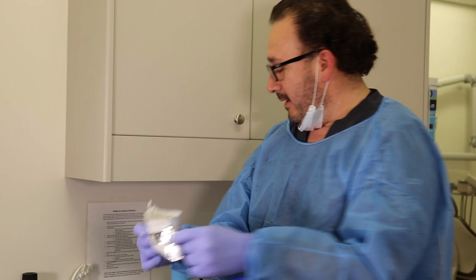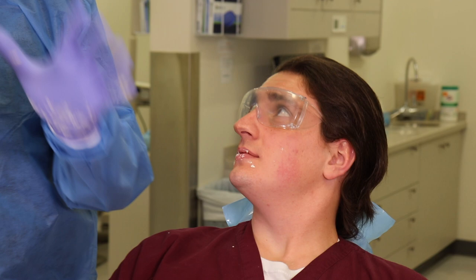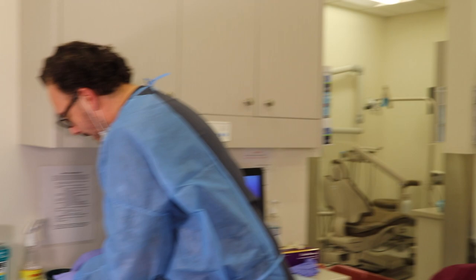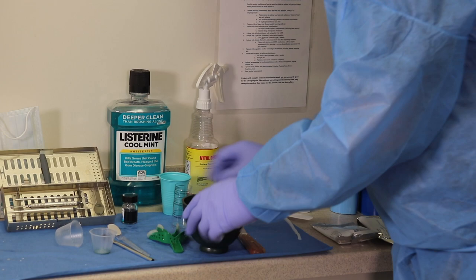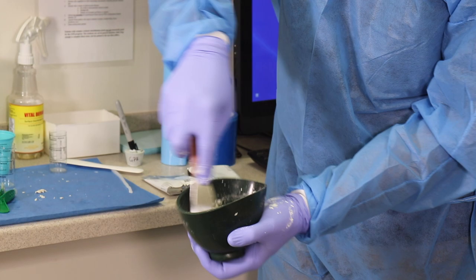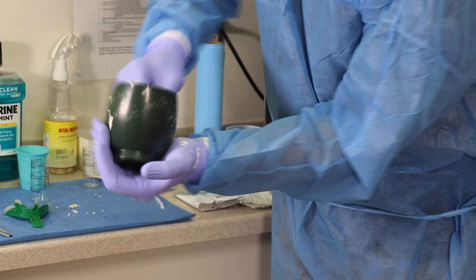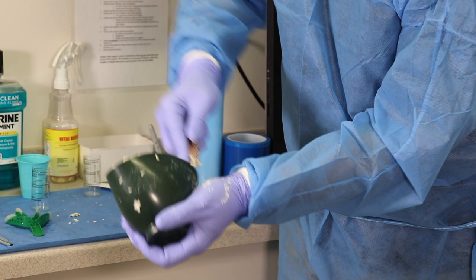You see, patients get all messy, it's perfectly fine. I don't mind for them to get messy right now. What I need is to get a very good impression. After that, they'll clean up and nothing's gonna happen. I do it again, I incorporate the water into the powder, right? I start incorporating this into a thicker mixture. Once I get this mixture pretty even and homogeneous, then I go onto the sides. And this movement here that I'm doing towards the sides or the walls of the bowl will give me that nice creamy consistency.